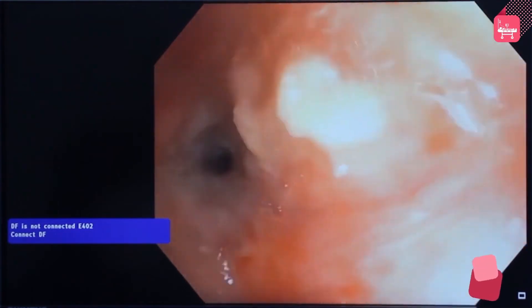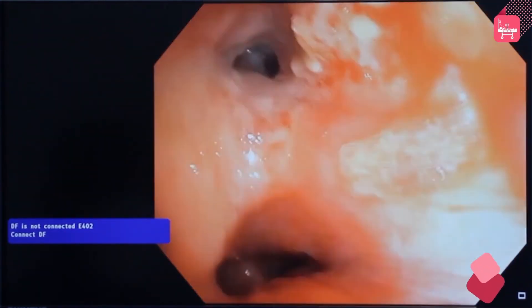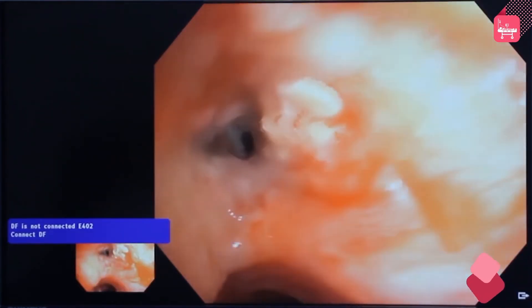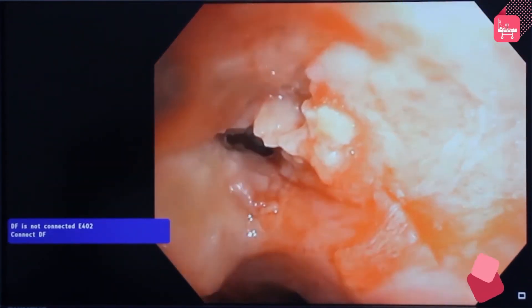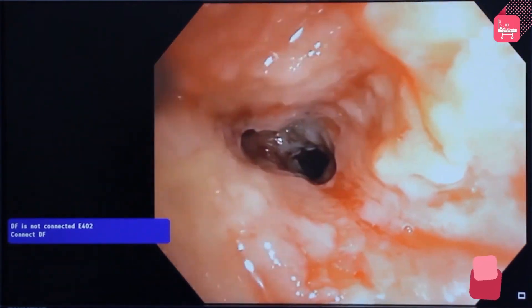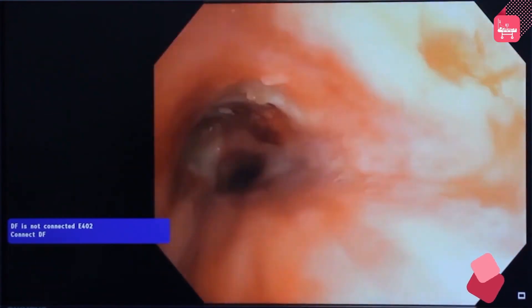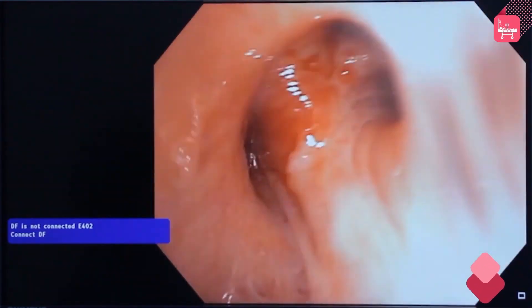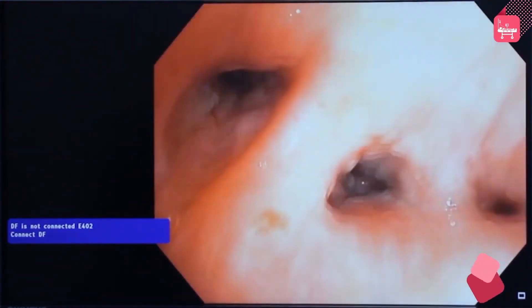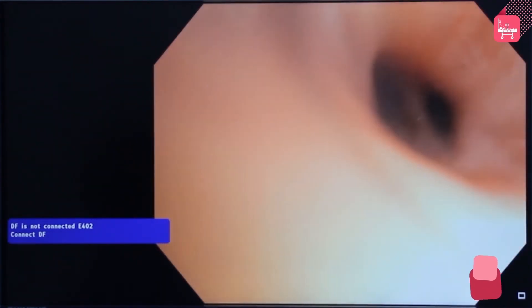Examine each part of the bronchus carefully. Overall, the bronchoscopy procedure requires 100 to 150 milliliters of saline. Instill 20 to 30 milliliters of saline for 5 to 6 times based on the requirement. Instillation of saline happens at different parts of the bronchus such as right bronchus, left bronchus, bronchus intermedius, and each part is examined carefully.